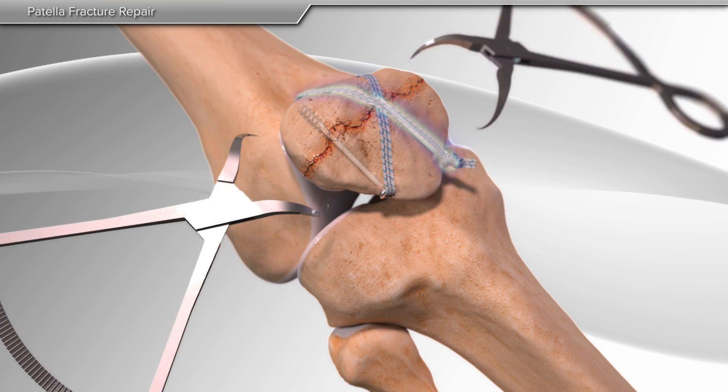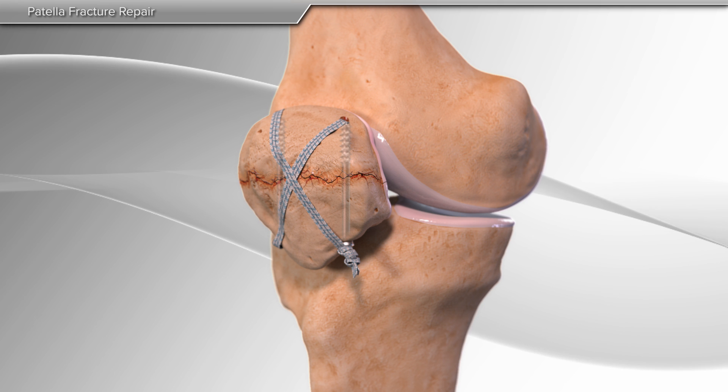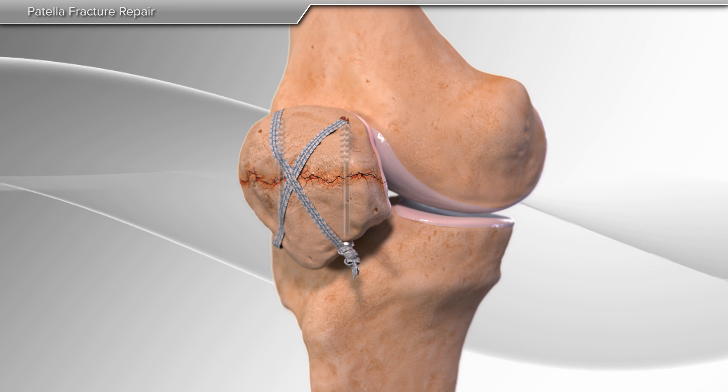Finally, the suture ends are tied to reinforce the repair and maximize healing. This completes the repair of the fractured patella.